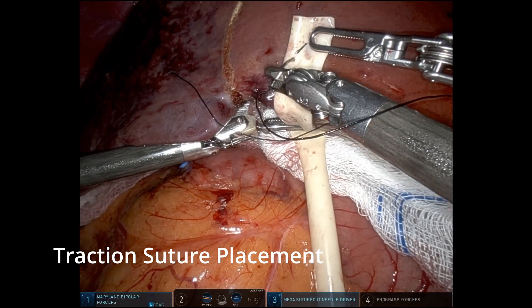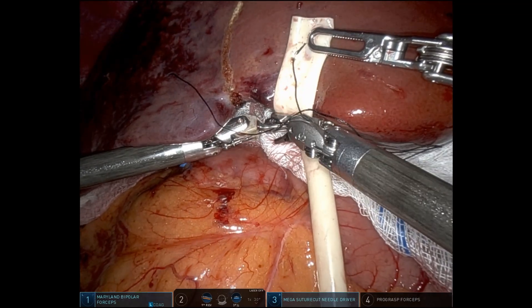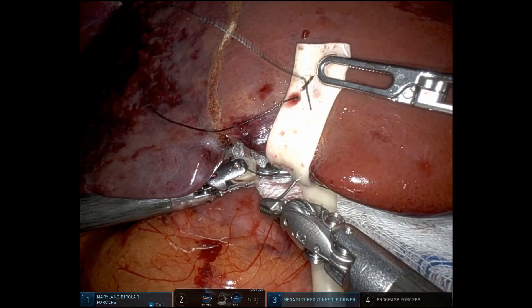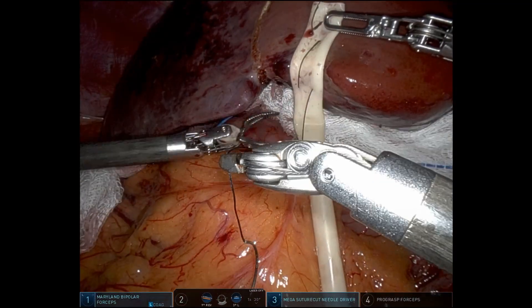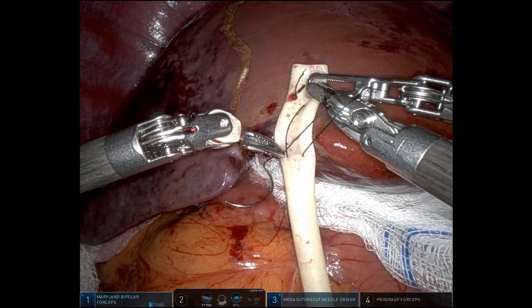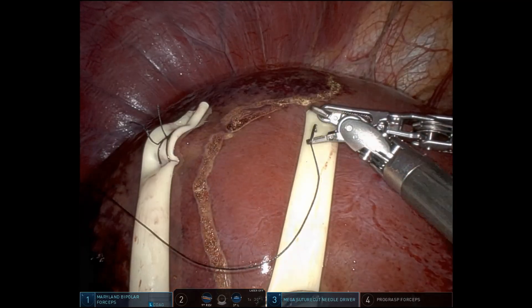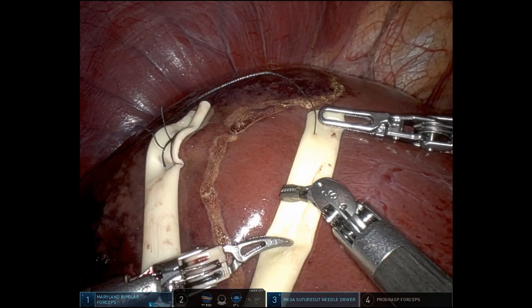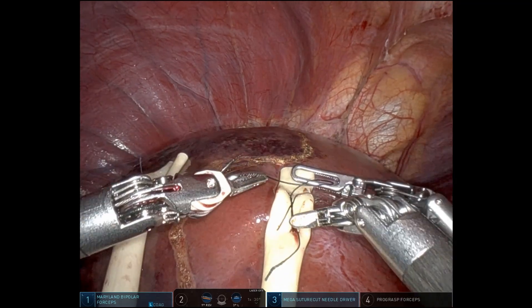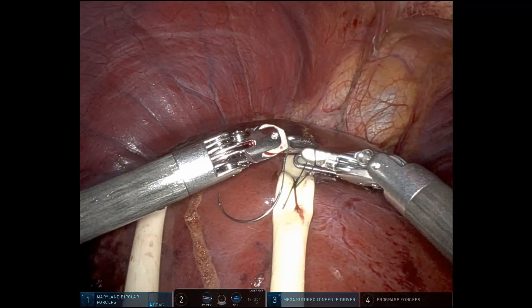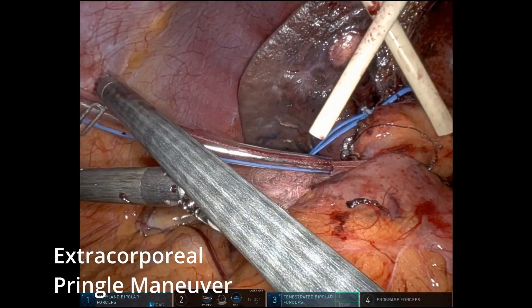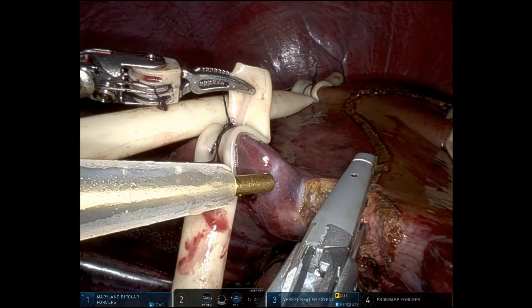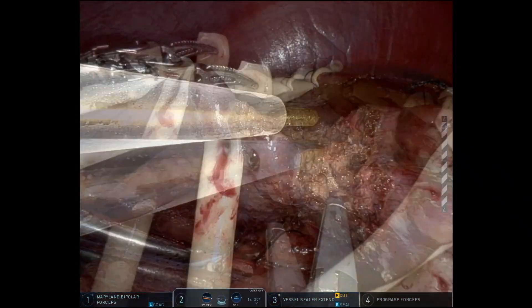Next, we're going to place our traction sutures. We use a 3-0 silk cut to 12 centimeters and a 10-centimeter quarter-inch Penrose drain. It's a figure-of-eight suture, and this provides traction. Typically one of the robotic arms — usually arm four — and then also the assistant will help with exposure during the transection. There's one on either side of the planned transection plane so that we can open it like a book. Here we use an extracorporeal Pringle with a 24-inch chest tube. We use Pringle routinely to try and make this as bloodless as possible.